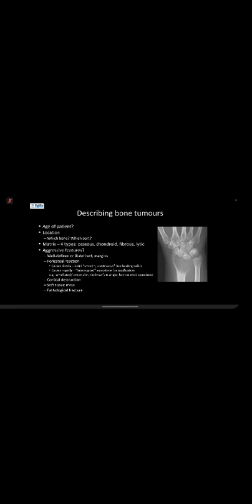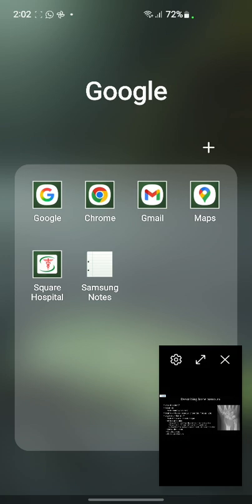Aggressive per se. When a lesion grows rapidly, you're having interrupted growth, so you're having more aggressive types of periosteal reactions, such as hair on end, spiculated, lamellated or onion skinning. Whereas when something is either slowly growing or healing, for example a healing fracture, that can be nice and smooth and solid and continuous, which is non-aggressive.